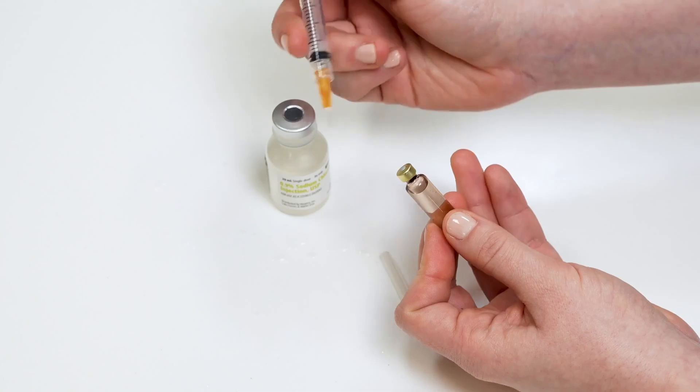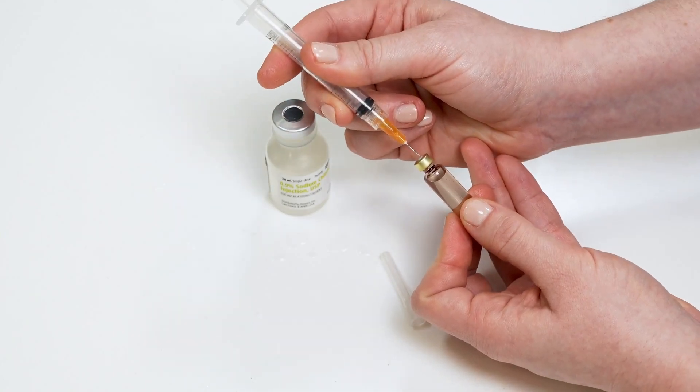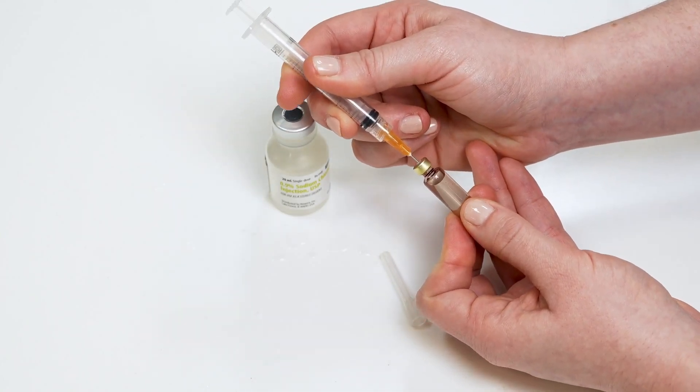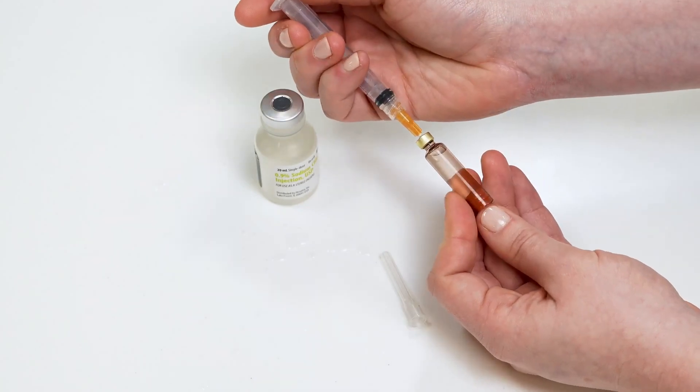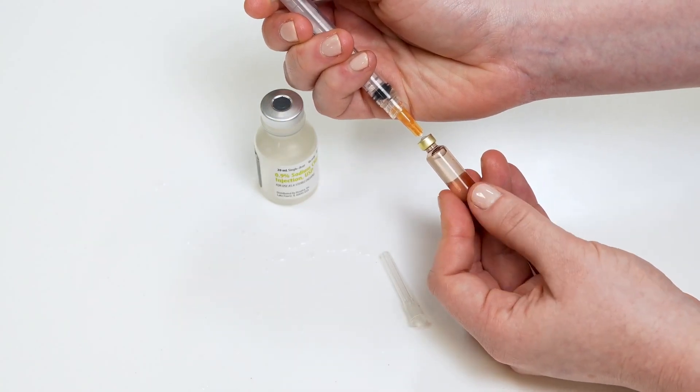Carefully reinsert the needle, but only push the needle in a little bit, so the tip of the needle is in the bubble. Pull back slightly on the syringe plunger rod to remove the bubble.